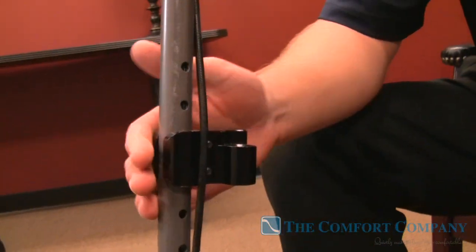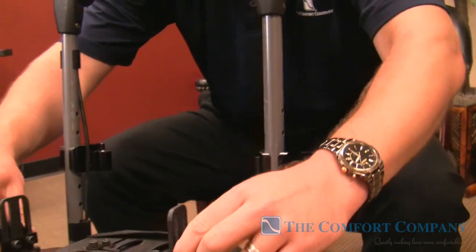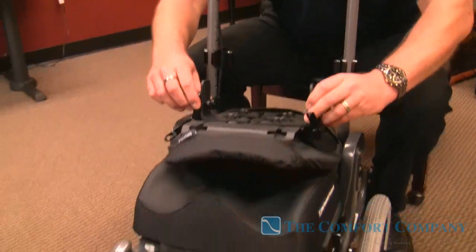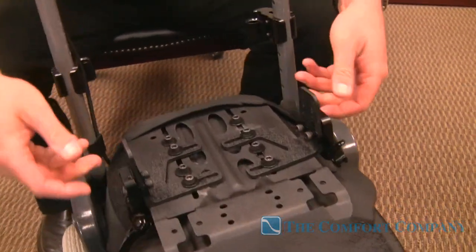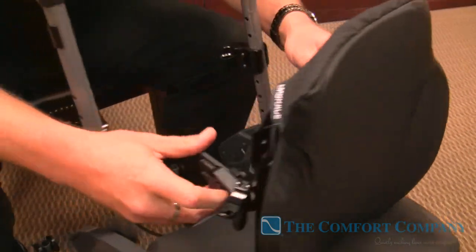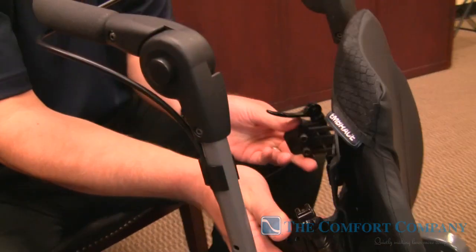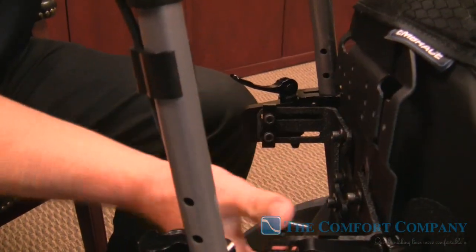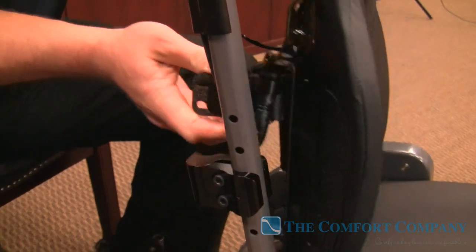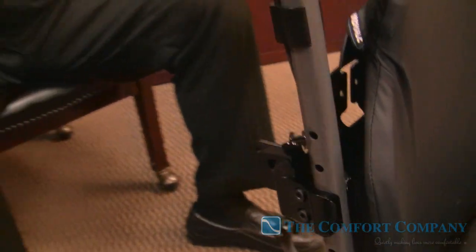We've mounted our receivers on the back canes, just about level — I've pre-done this, but it takes just a couple seconds to get these on. With everything loose, we have all the adjustment in the world to angle these. We're going to grab hold of the plungers, fit one side of the plunger into the receiver — everything is loose — then take the other side and fit the plunger into the other one. There was no struggling.